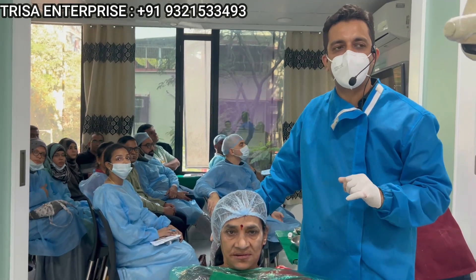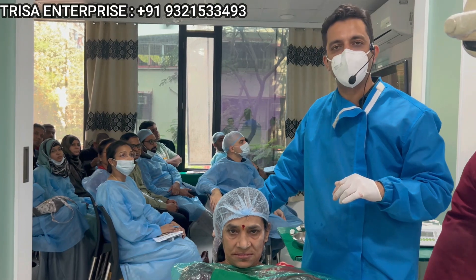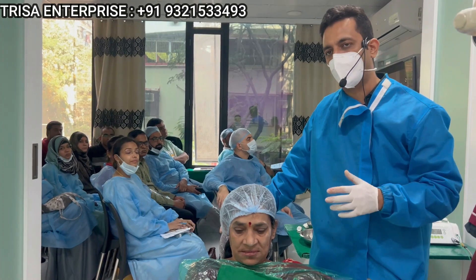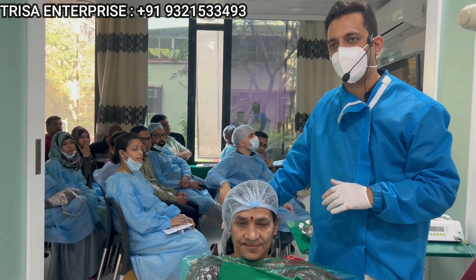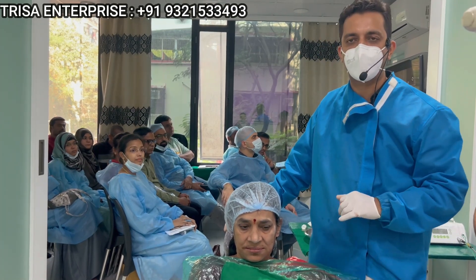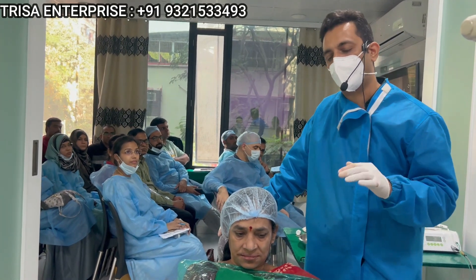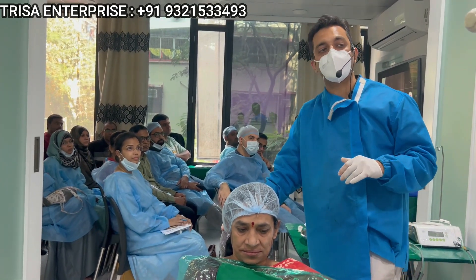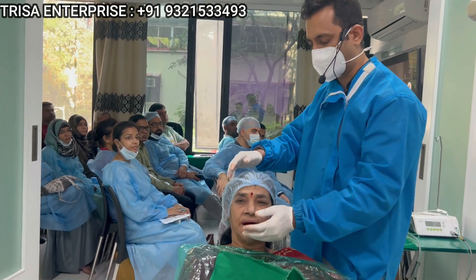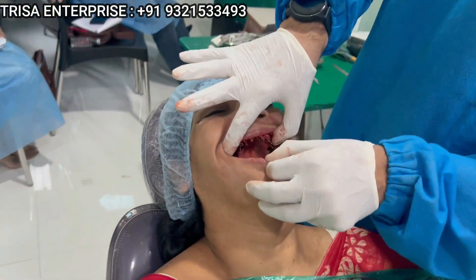Hi friends, this is Dr. Rowan Virani, our mentor for basal implants. Today we are on day two of our basal implantology course with all our doctors from across India and one from Iraq. We have done the full mouth implant placement for this wonderful lady. Before I go ahead to show you how to take the accurate jaw relation, I want to show you all the implants — just have a look at all the implants which are placed.